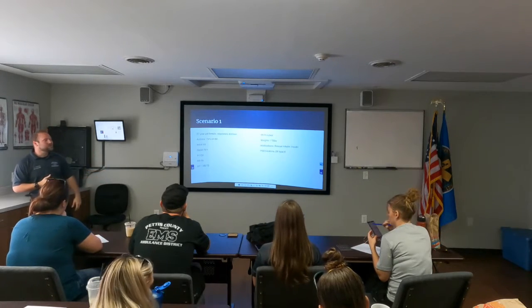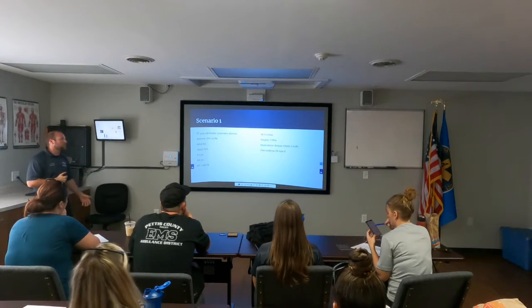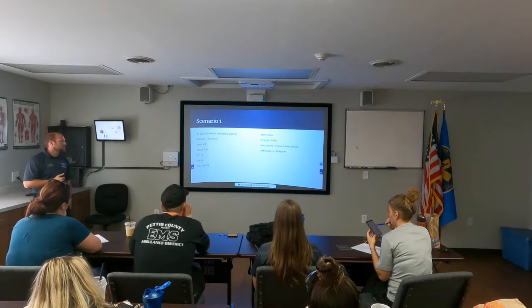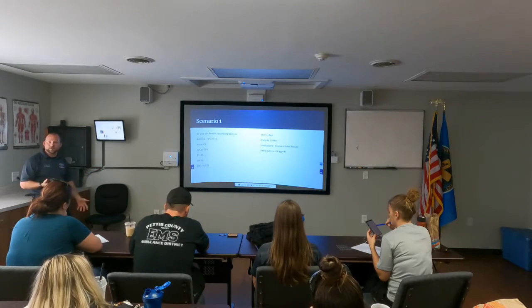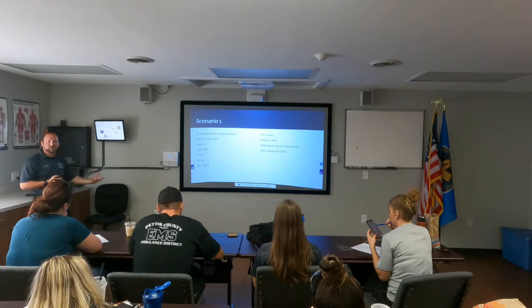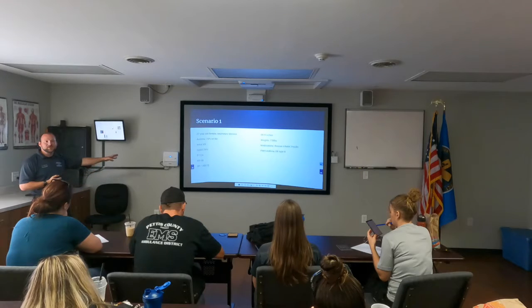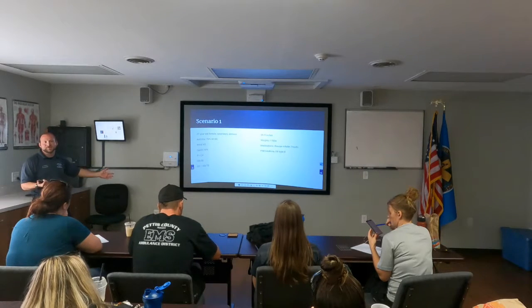So you're responding to a 27-year-old female, respiratory distress on room air. She's 76%. She has a heart rate of 120, sinus tach on the monitor, respiratory rate's 38, blood pressure is 140/78. As far as what we see, what's our biggest concern for this lady?